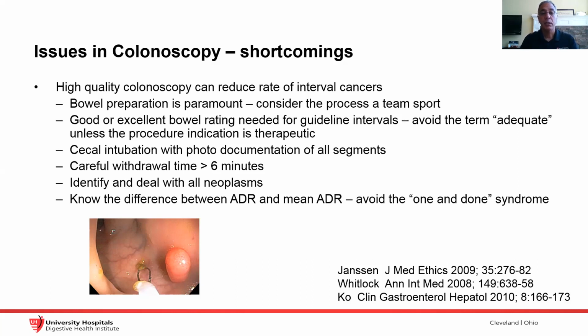Your careful withdrawal time is a minimum of 6 minutes on average. We encourage gastroenterologists to withdraw up to 8 minutes in time. We don't count off time for removing polyps. Ideally, you're going to identify and deal with all neoplasms, and you should really know the difference between your adenoma detection rate and your mean adenoma detection rate, so you can avoid the one and done syndrome.